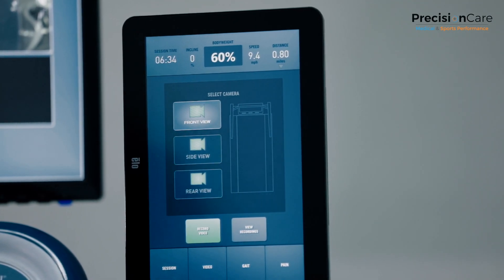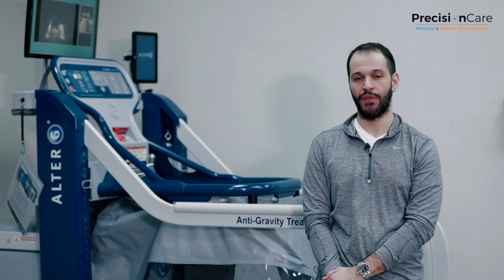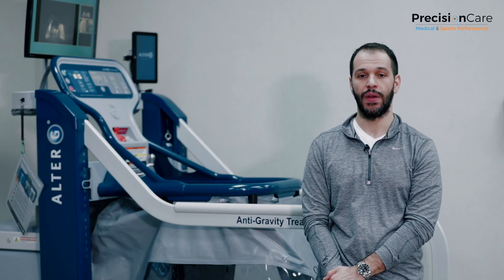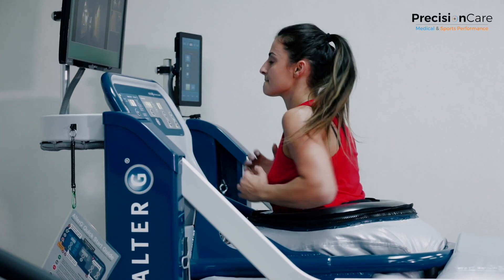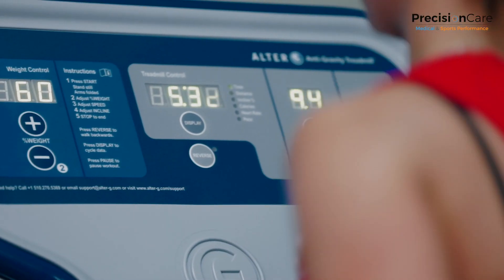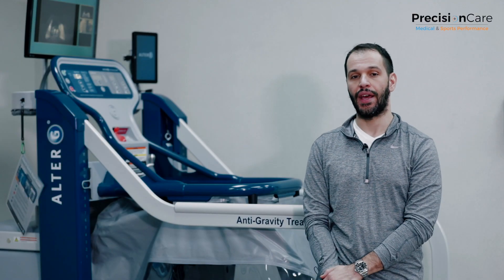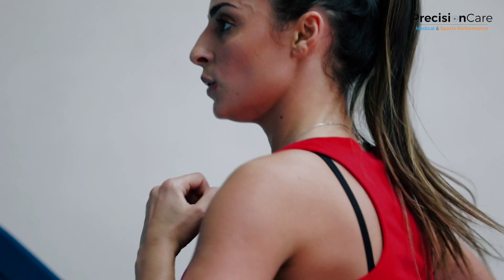We use this treadmill for training, for marathon runners, for triathlon athletes, but some of the other implications are really injuries. If someone sustained an injury and they're actually getting surgery for that injury — for a lower extremity injury — we're able to put them in this treadmill, in this weightless sort of environment, and we can actually get them walking and weight bearing a lot quicker than someone who is not able to do that.